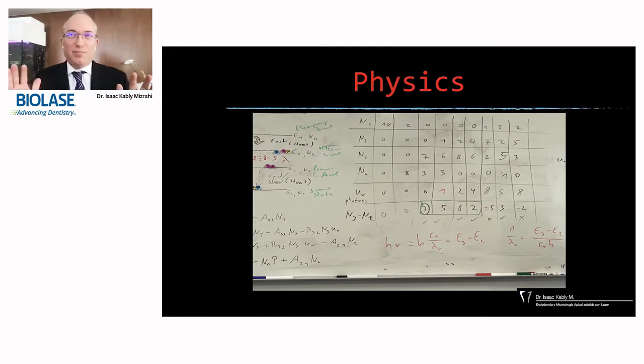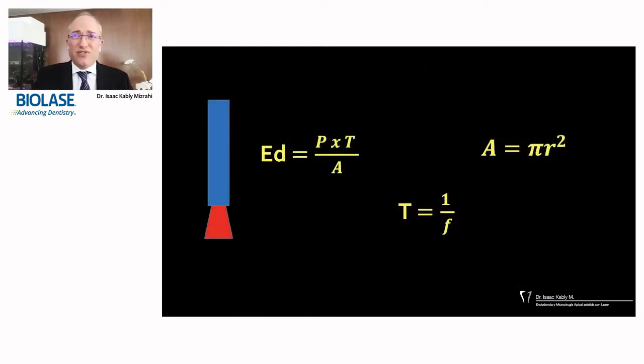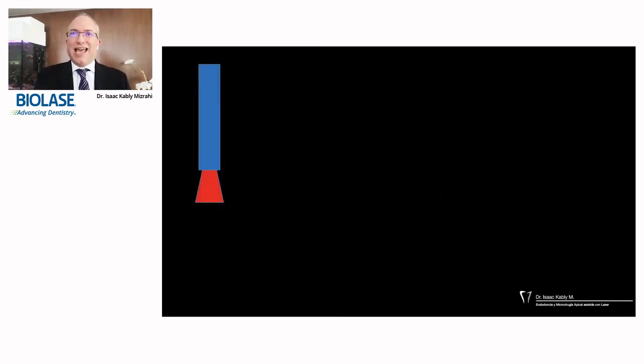I will go deeply into it, but we need to mention the importance of physics to understand what we do with lasers. Because we can measure the amount of energy we're using to interact in every particular and special way. We have really different formulas to calculate that energy density and the amount of energy being delivered to the root canal walls in this case.